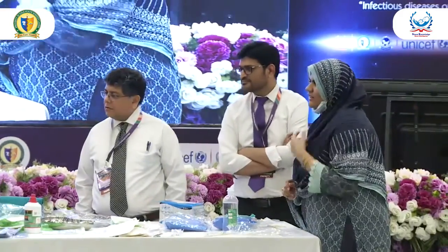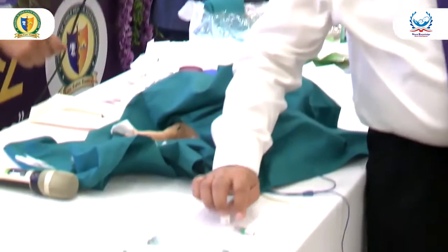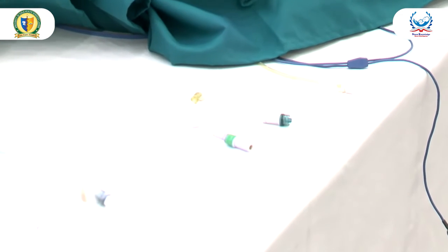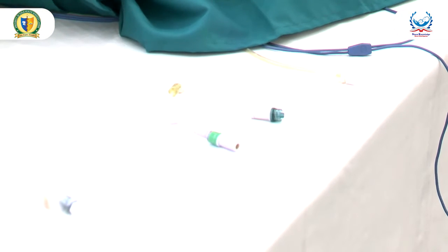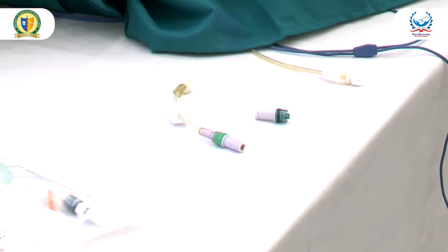Okay, so this is just a simple thing. The other one, green one. Needle-less connector, yeah, this is the one. So this is the needle-less connector. You can connect from here and you connect your syringe. The advantage is that it is sterile and the chances of getting infection is very, very low. This one is also needleless. This is another device.